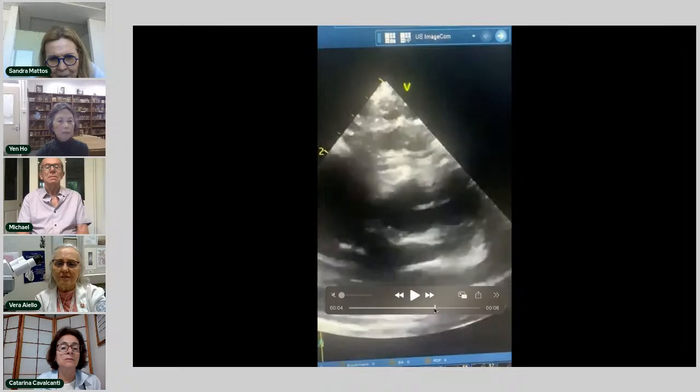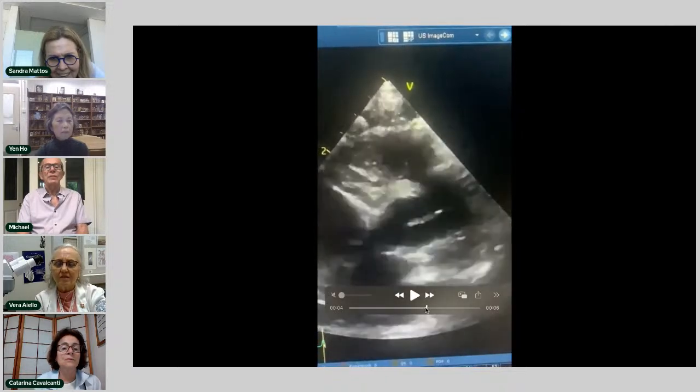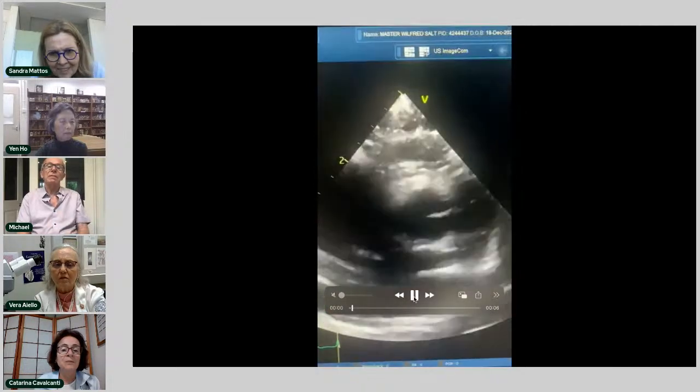It's just because it's a little bit extended. It's kind of one of those, but it's pretty obvious. In that view there, you can just point out the right coronary artery. Yeah, that's the right coronary artery, and that is the rather beefy right coronary artery. And then you just play that on a frame or two, you'll see coming from that is a blood vessel going across to about 3 o'clock.